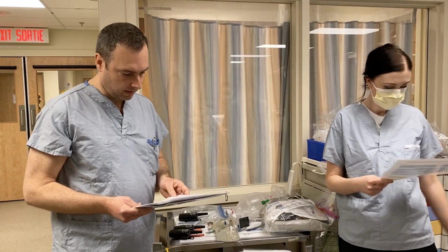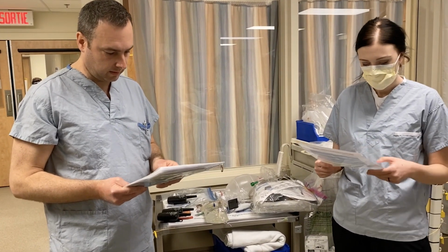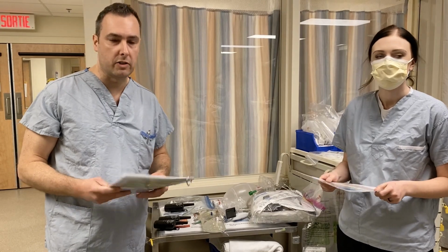Yes. Yep. And we have our ambuscope. Yes. Excellent. And we have direct laryngoscopy in case we need it. Correct. And the ventilator is already in the room. Yep. Excellent. So we've confirmed our airway checklist.